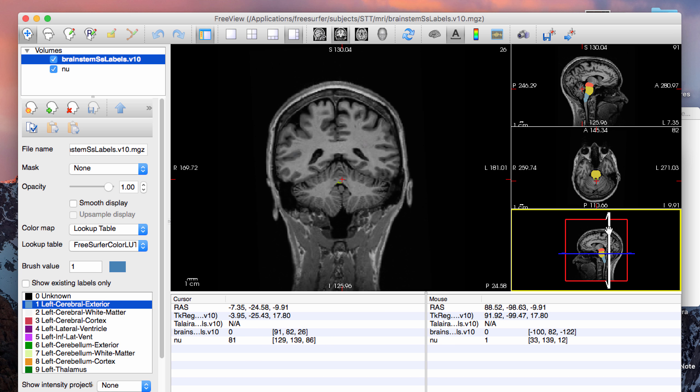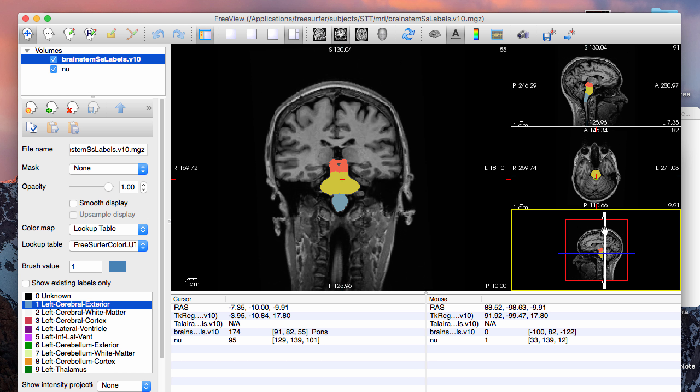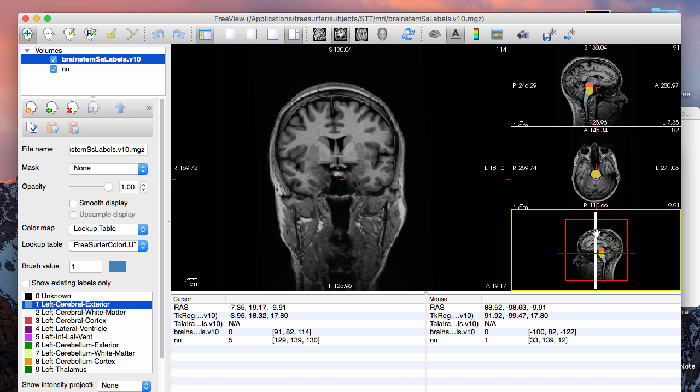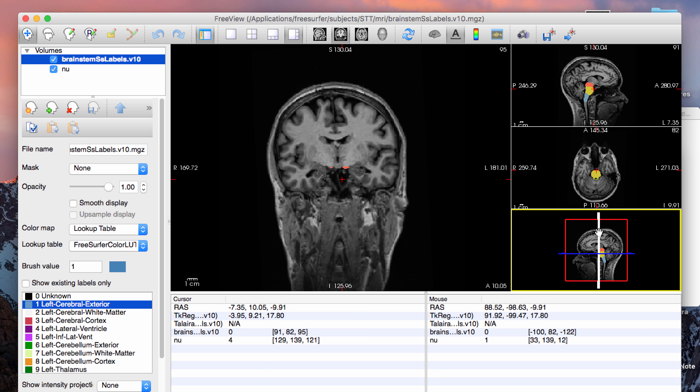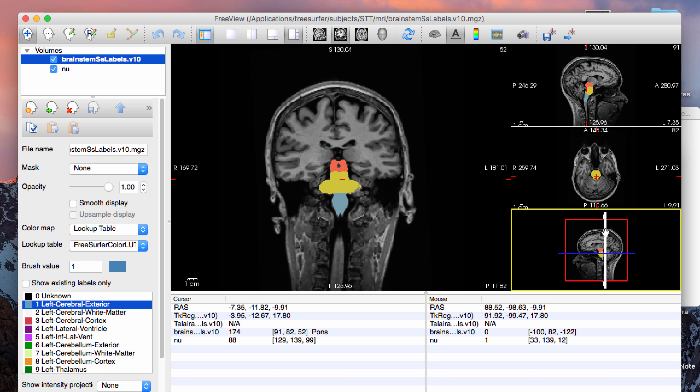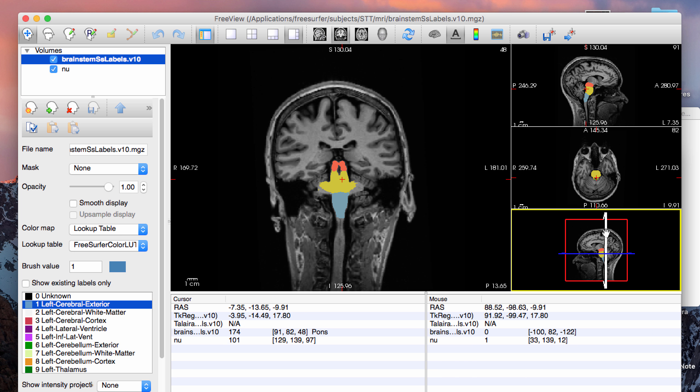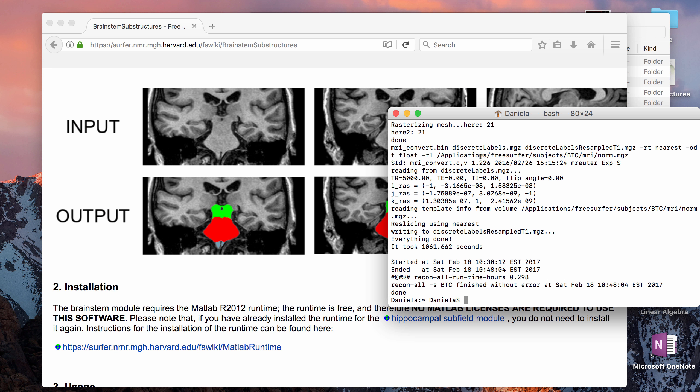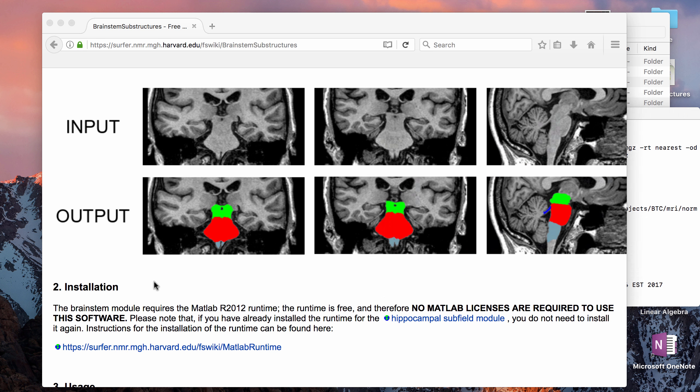I'm just going to pass through in the coronal view so you guys can get an idea of how it's segmenting the brainstem. Okay, so the terminal is finished running. It tells you in seconds for some reason how long it took, but if you look here it took about 18 minutes and it says it finished without error.